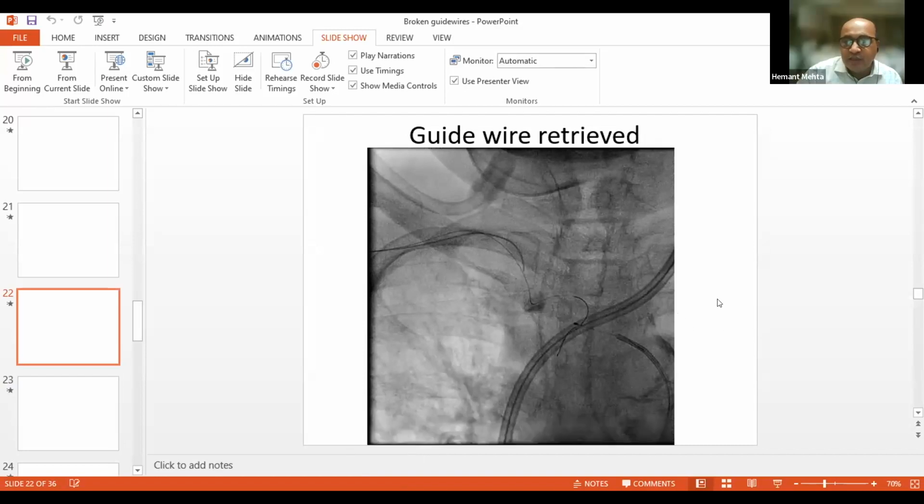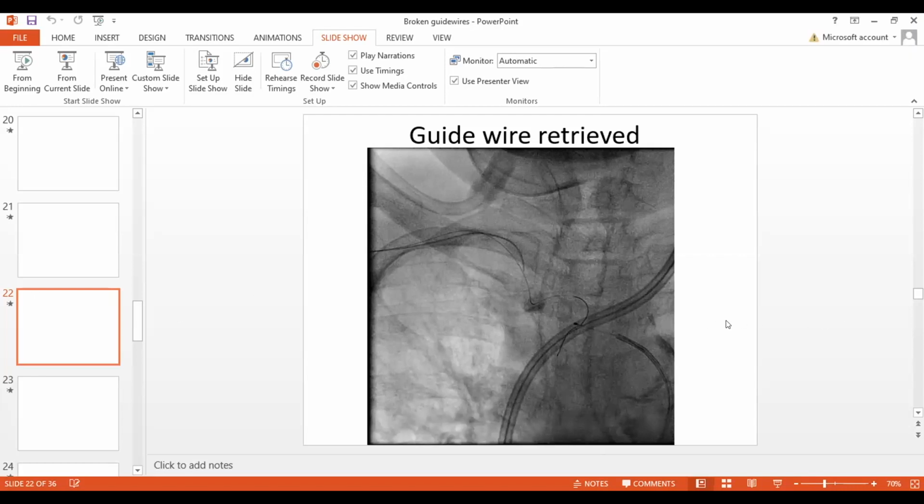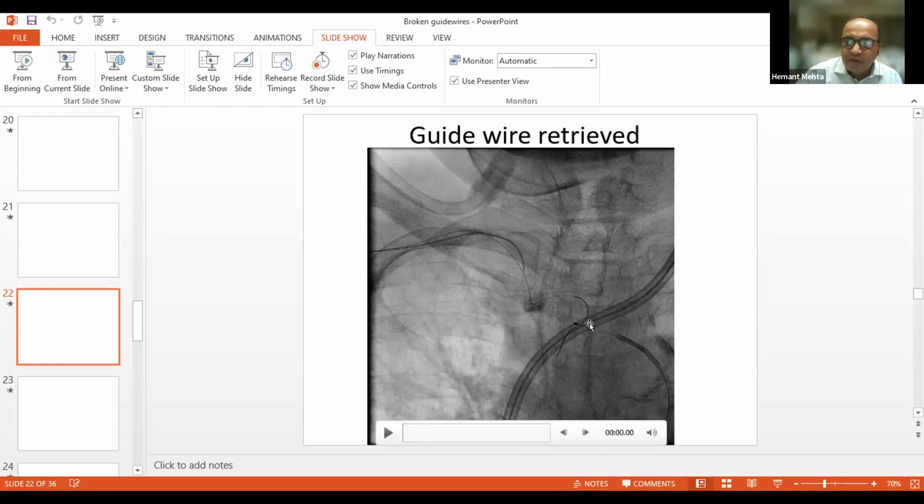We didn't want to lose anything now. So you have parked that wire. You've come via the fistula vein across the anastomosis and up to the subclavian artery. Somewhere here we pushed, so the balloon would have blocked it. Otherwise, when we try to manipulate something here, the wire may migrate backwards into the forearm or wherever. So the balloon was blocking it. We knew that end is secured, so we can do some manipulation here and try to catch hold of it.